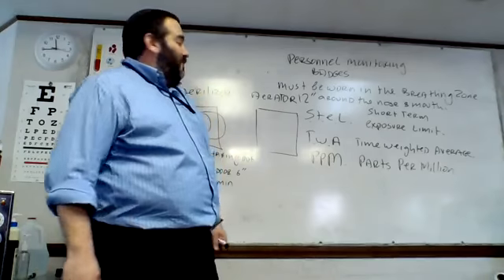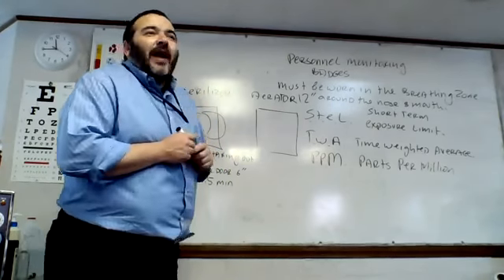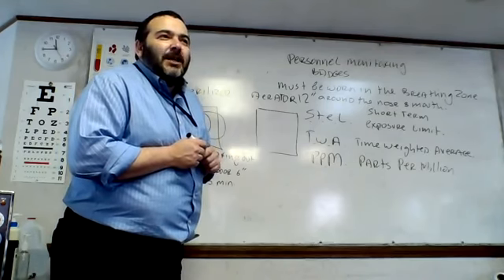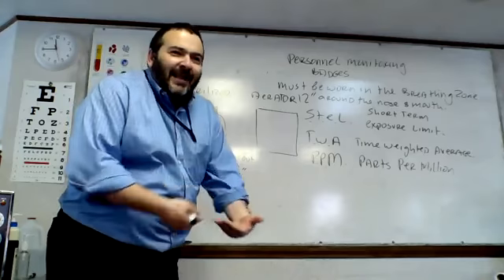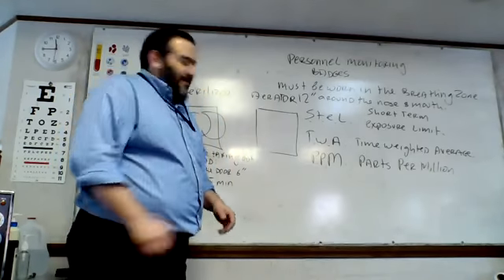Then take your load and transfer the load onto a stainless steel cart with a solid bottom and closed doors. I'm too lazy to write that down. Okay.